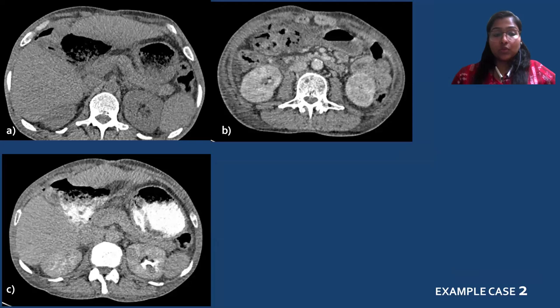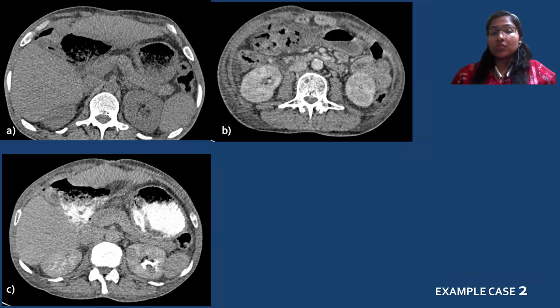This was a case of a three-year-old patient with traumatic injury. In the first image, pneumoperitoneum can be seen. In the second image, a collection in the sub-hepatic or pre-pyloric area was identified with gastric contents, multiple hyperdense areas, and air foci within. Upon oral contrast administration, contrast extravasation was seen, confirming the site to be the pyloroduodenal junction.